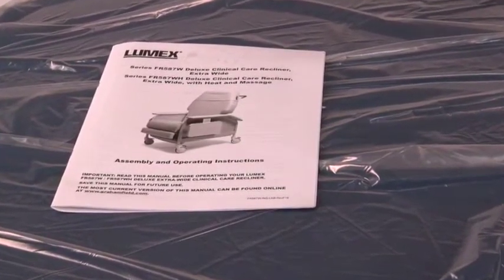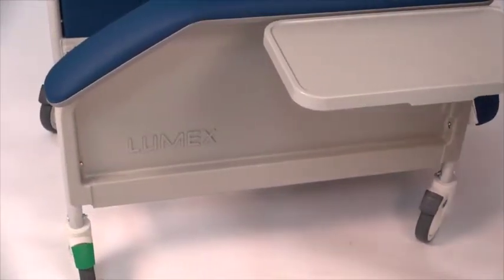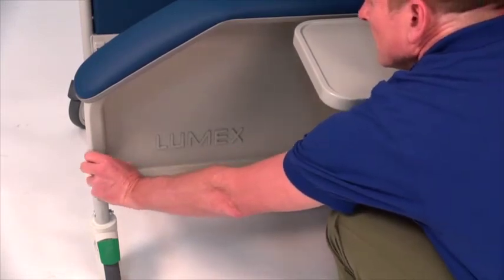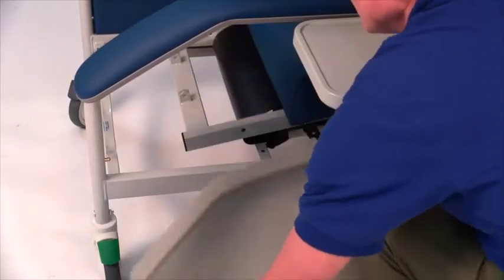Remove the two side panels from the recliner by depressing the two brass push buttons located at the sides of each side panel. While depressing the push buttons, hold the side panel gently away and down to release. Set side panels aside.